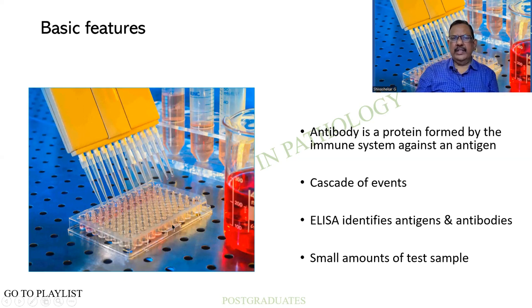There is a set of 96 wells, and these are fed with the sample, which is being delivered to each of the wells. The wells are fed, and then subsequently you find that the antibody, etc., is being added. You find that the microtips will be discarded. In this one, normally you find that there is a single sample for a single test, but sometimes multiple samples for multiple tests can also be used. Such is the advantage.